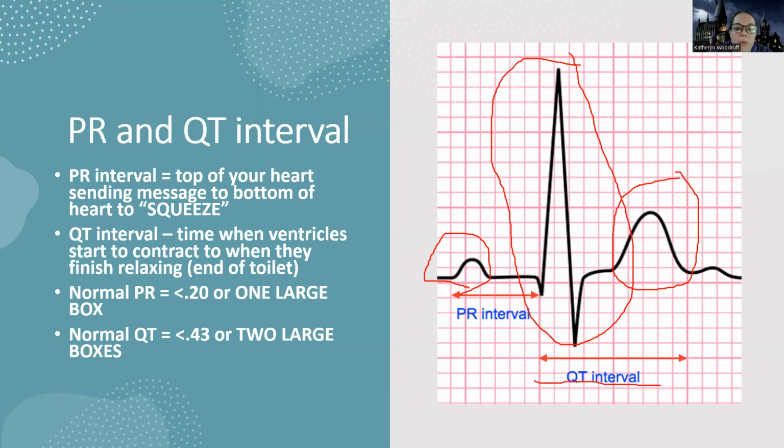But even more, this QT interval, you're going to see this mentioned a lot in drug books. You're going to see people talk about, ooh, if they have a prolonged QT interval, it's really super dangerous. Or like these meds cause a prolonged QT interval.